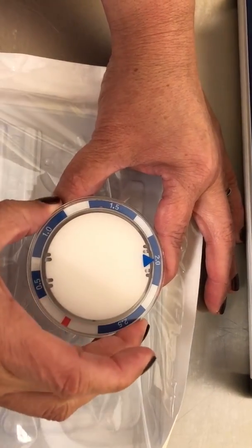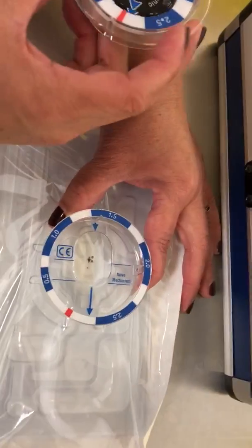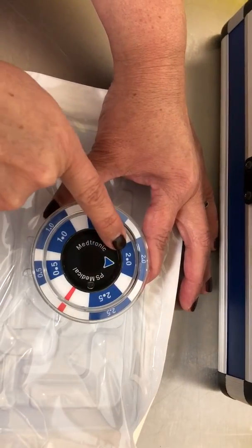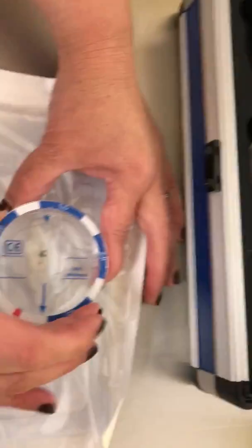We take it out and we take step number two. We align red with red to verify that it is at 2.0. We take it out.